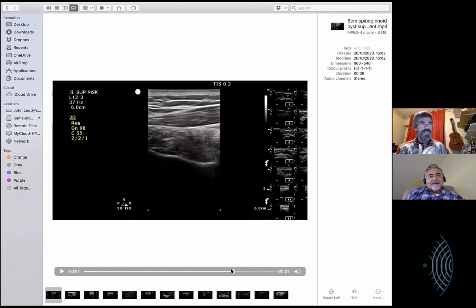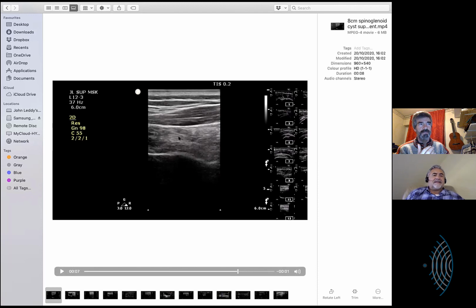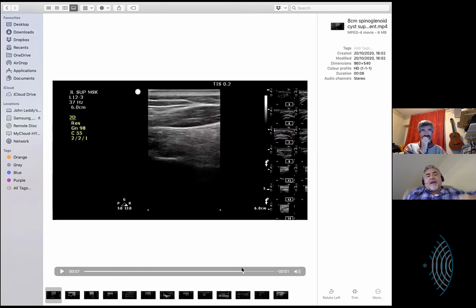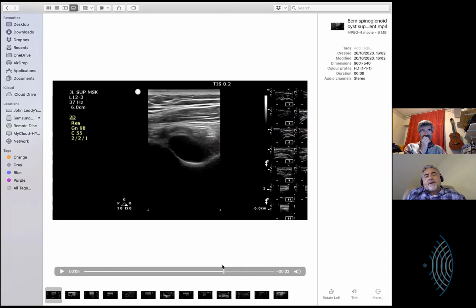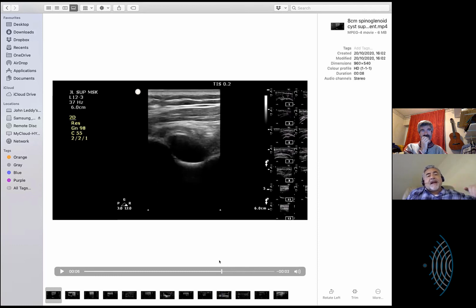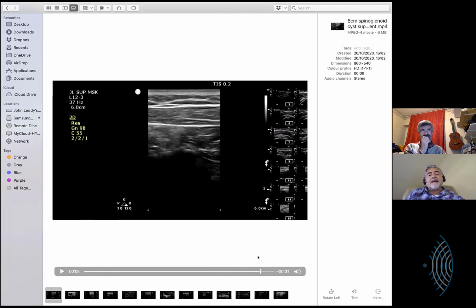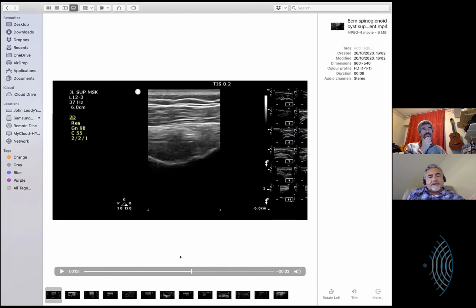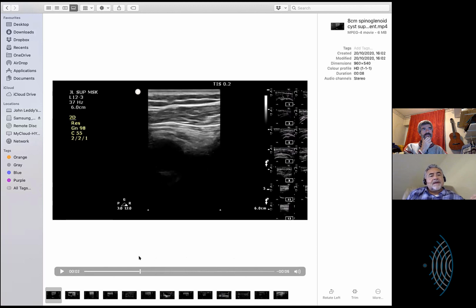And this is what you see. There, you see that's the infraspinatus, short axis of infraspinatus. Yes. Unbelievable, John. This has to be a case, buddy. This does so many things because it shows the location of what I call a posterior window, where you're looking for labrum, where you're looking for the humerus, the glenoid, and then we see it off to the side, and now you basically slide more medial, and you're looking at the infraspinatus. Yeah.